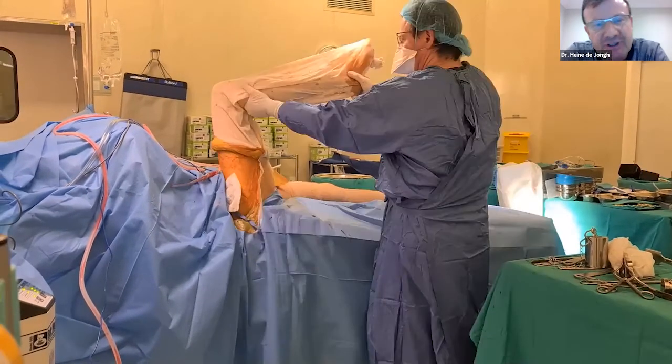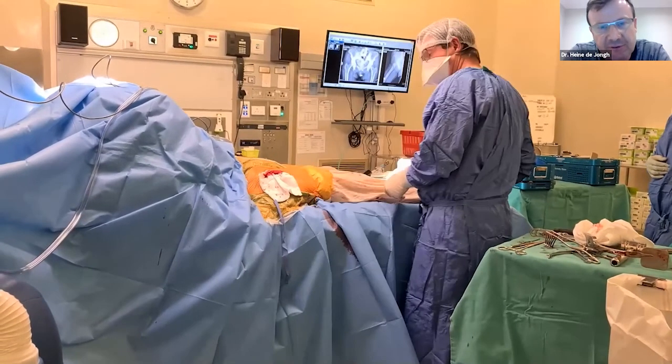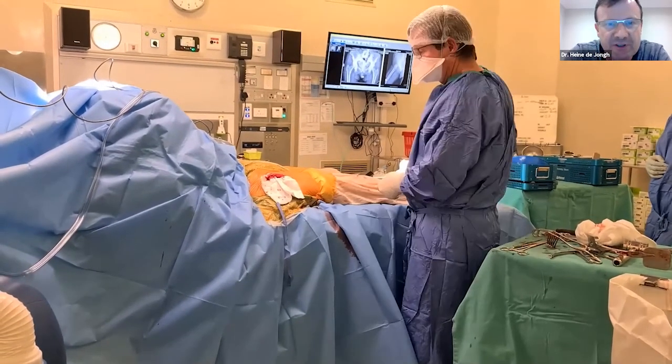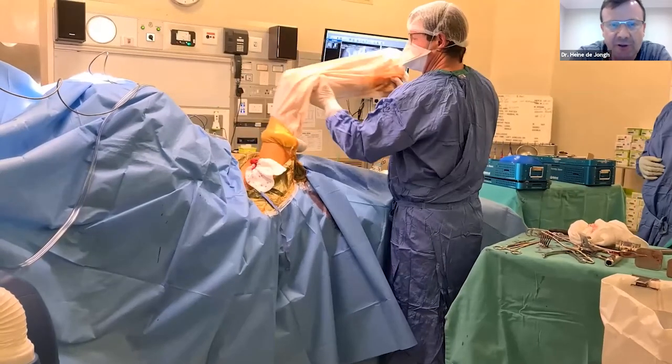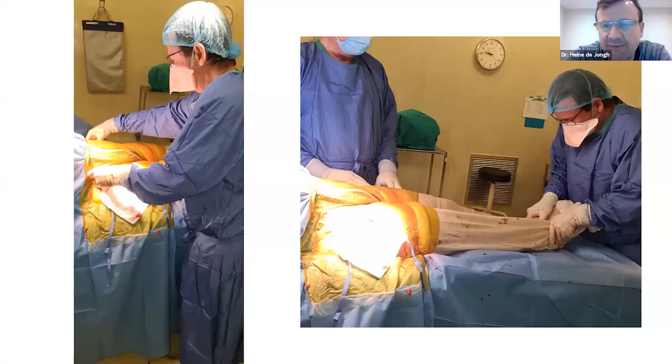The fact that you use an anterior approach doesn't mean that you can't dislocate. So this is a clear example of a posterior dislocation, sinking feeling. I have to go back to the basics, and we combine this with a leg length measurement. So again, I can feel my anterior iliac spines very clearly, and I do a proper true leg length measurement. You can do Galeazzi, whatever. Once again, it makes me feel very safe and comfortable.